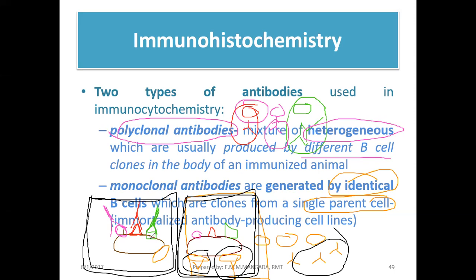So if you can see this antigen here, it has different types of epitopes. At yung nagbabind sa kanila na antibody are antibodies that are directed specifically to that epitope. Your pink antibody cannot bind the green epitope, right? Your red cannot bind the pink. So it will just bind the red. So with the green, it will just bind the green.